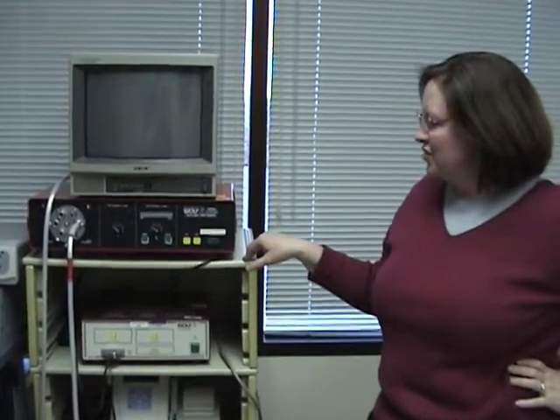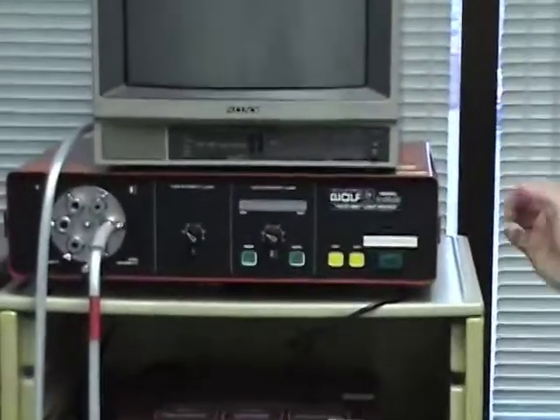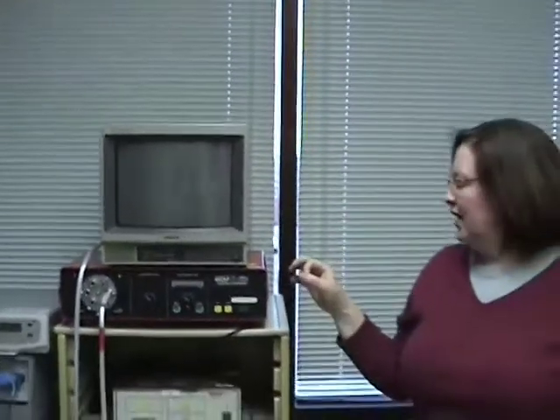This is our hysteroscopy machine, and what it does is allows the doctor to insert a small scope device into a woman's uterine cavity, and through the camera and the light source, she can see on the monitor all the internal tissue and structures inside the uterine cavity. Then she can look for fibroids or polyps and get a diagnosis why a woman might be having bleeding, or she can zero in on particular cells or objects that she wants to take a sampling of to send off to pathology.